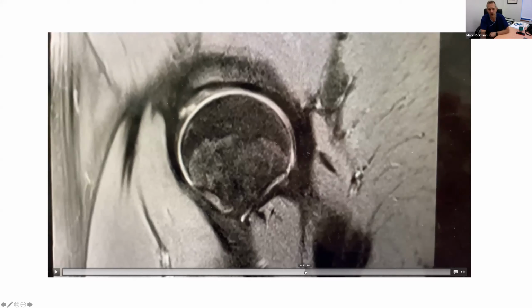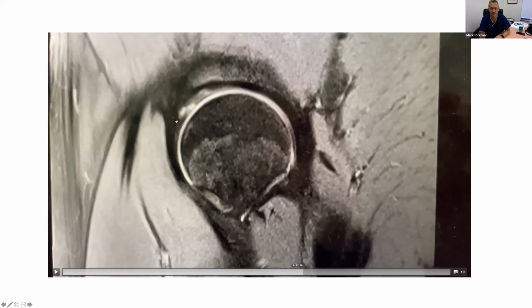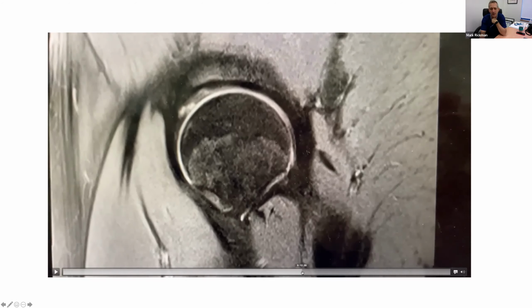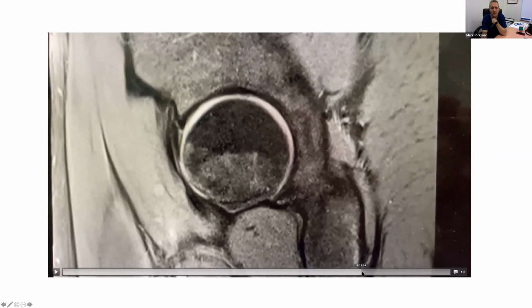And then up at the top there, let me just pause that and run it back. Up here, you can see that there's clearly a lot of upset. This is chondral surface coming around here. That's the edge of the bone. This is the labrum. This is the chondrolabral junction, and it's very upset with life there. And so we're expecting to see some damage inside this hip. And he's clearly got a labral tear, and you can see fluid coming all the way through here. So his labrum's obviously torn as well.